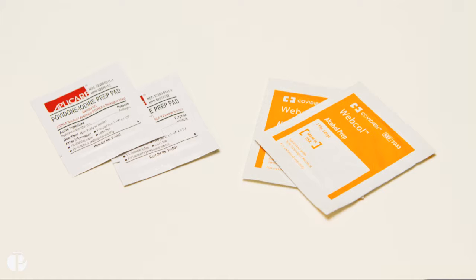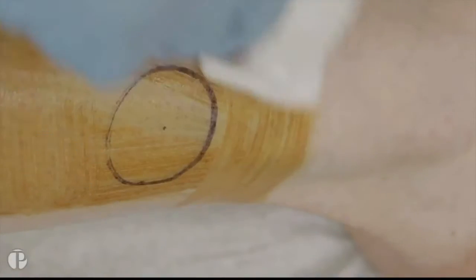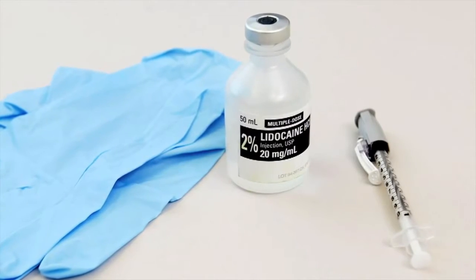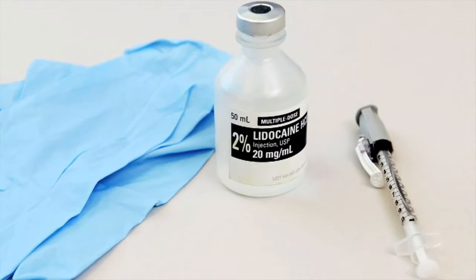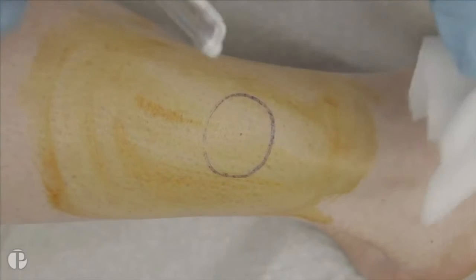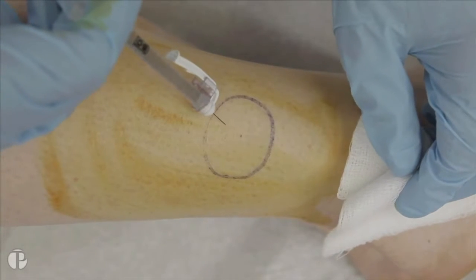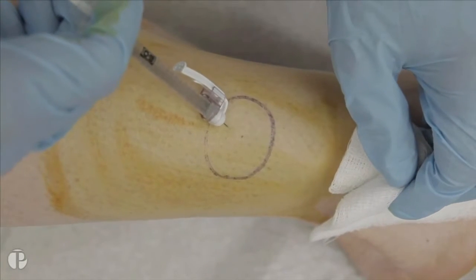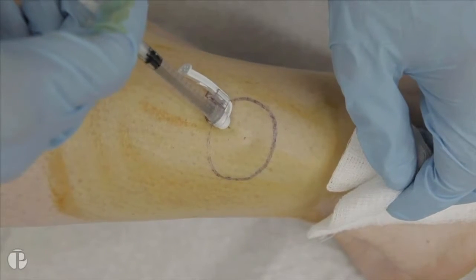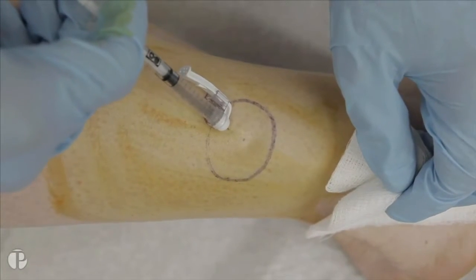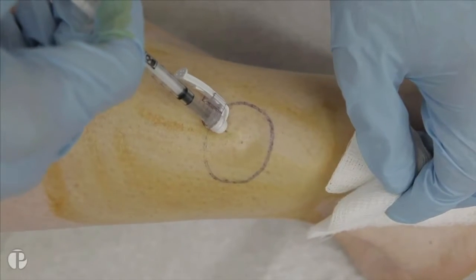Prep and clean the chosen biopsy sites with the supplied alcohol and iodine swabs. After cleaning the biopsy site, you will use the lidocaine and injecting needle to numb the patient. Inject the lidocaine into the subcutaneous tissue surrounding the biopsy site. Keep in mind not to inject the needle through the biopsy site. With the lidocaine, create a bleb or bubble underneath the dermis. Check that the area is numb before performing the biopsy.